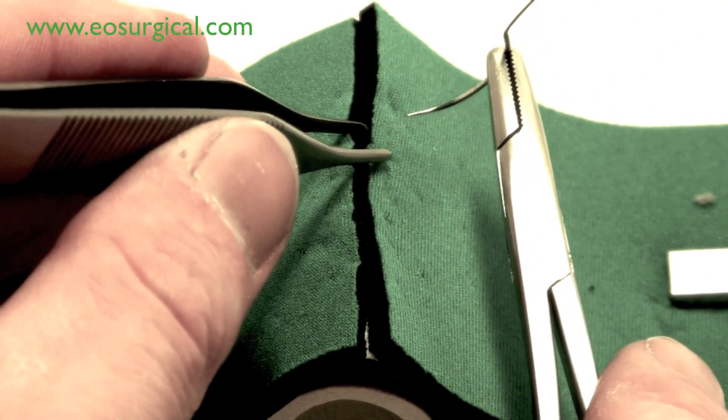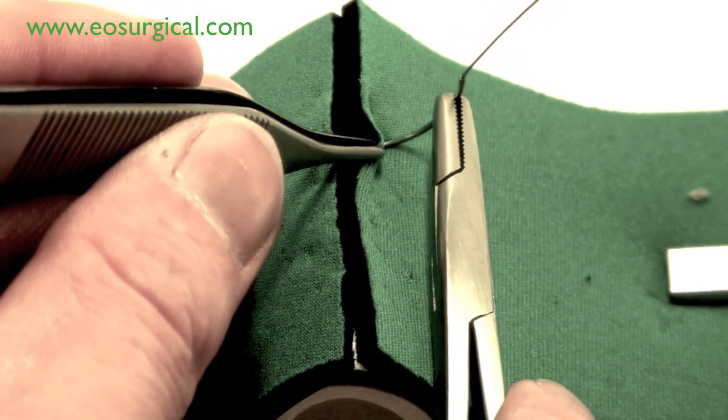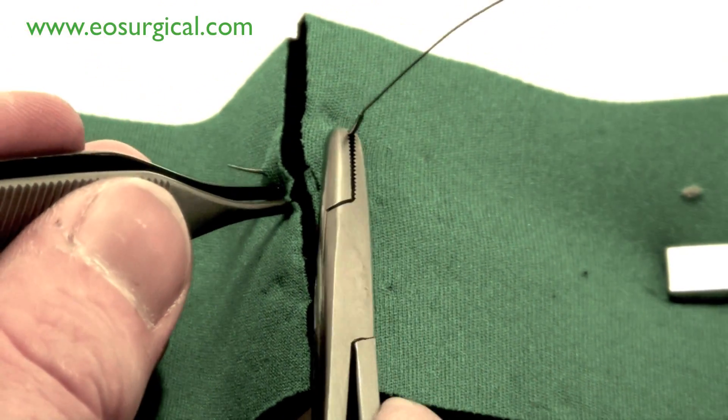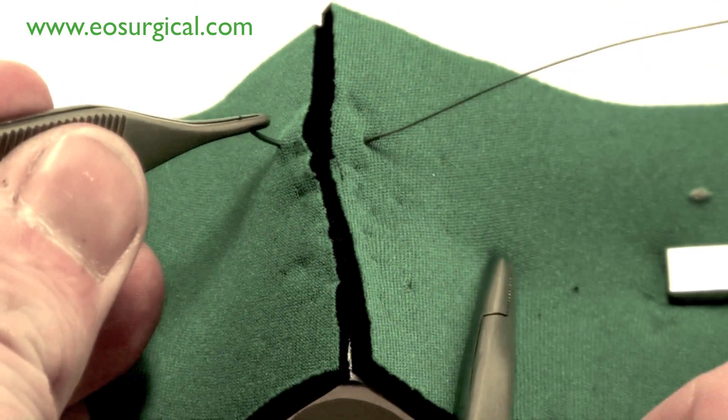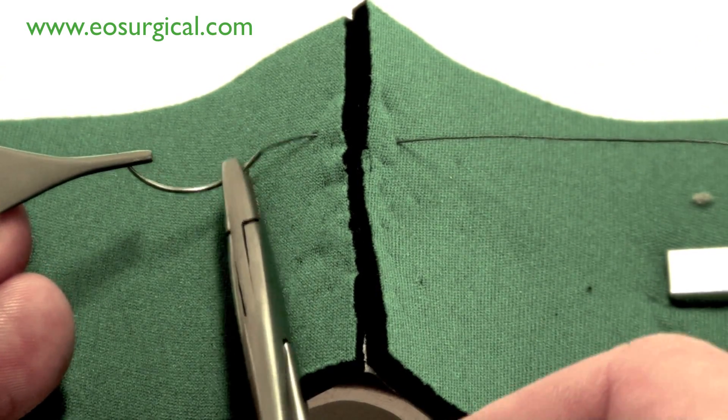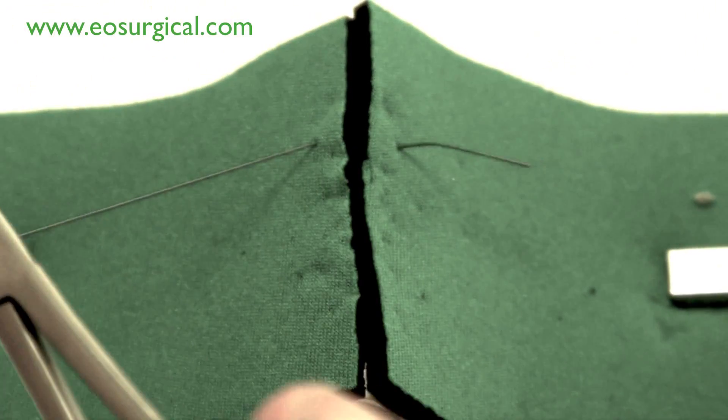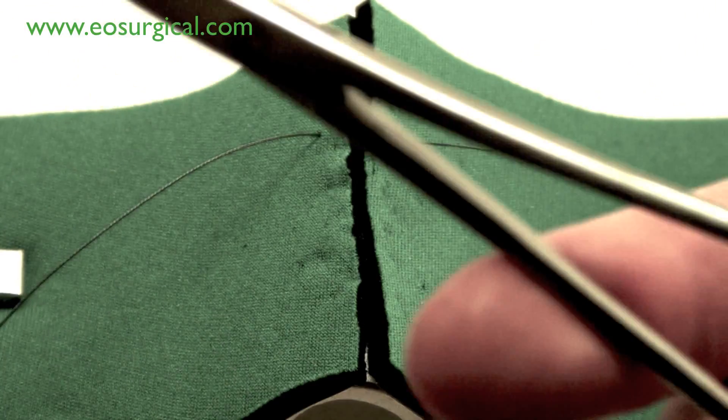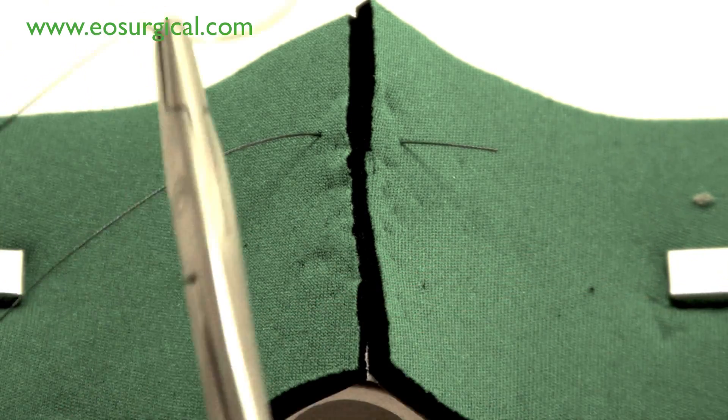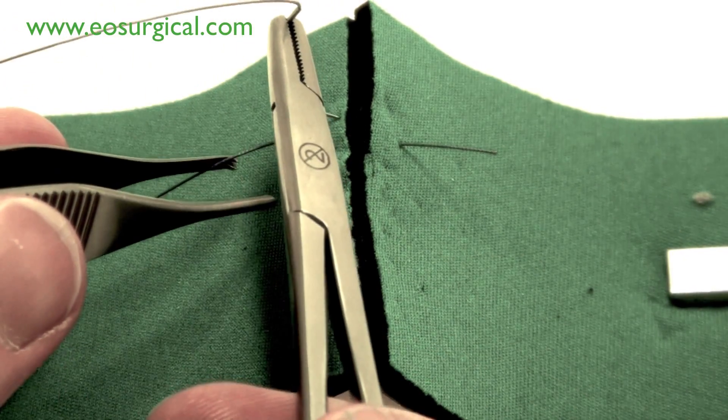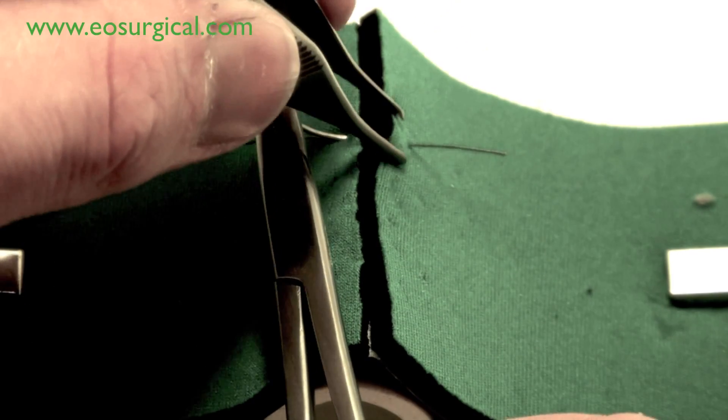Now looking at it on the simulator, first take a relatively large bite all the way through the tissues before reversing the direction of the needle and passing it through closer to the wound edge.